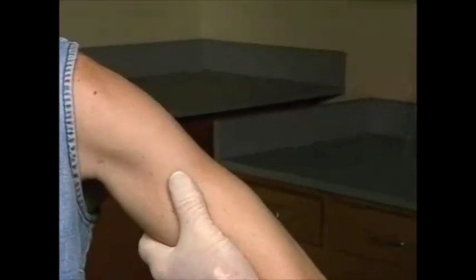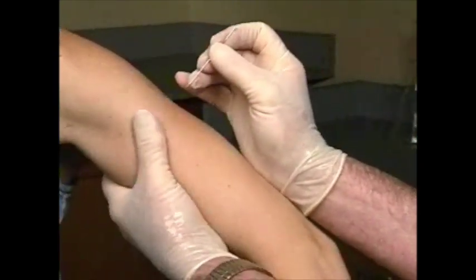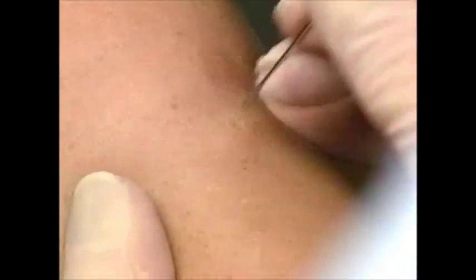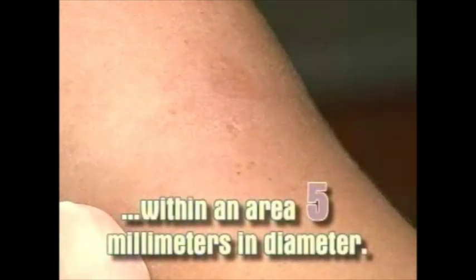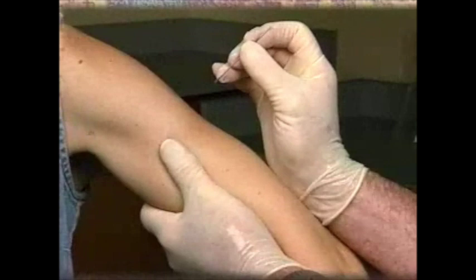Pull the skin on the arm taut. Rest your wrist on the arm and prick the skin 15 times as shown here. This should be done rapidly, perpendicular to the skin within an area 5 millimeters in diameter. The intention is to break the skin and introduce the vaccine into the skin. The wrist of the vaccinator should be resting on the arm while pricking the skin. Enough pressure should be used to visibly push down the skin and produce a trace of blood at the vaccination site that appears 10 to 20 seconds after vaccination.